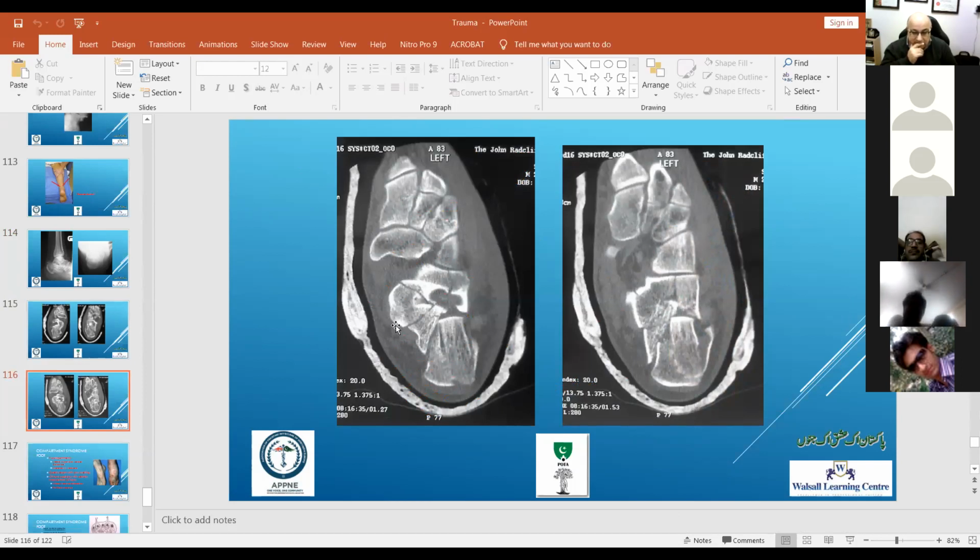Sir, with the buttress plate, sir. No. Before you go to the buttress plate, you need to tell me the basics. So what type of fixation? This is a different type of fixation. This is a fixation that happens nowhere else in the body. There is a name specifically for calcaneum fracture fixation. So initially, we'll go for a preliminary fixation, and there's a particular name for it.